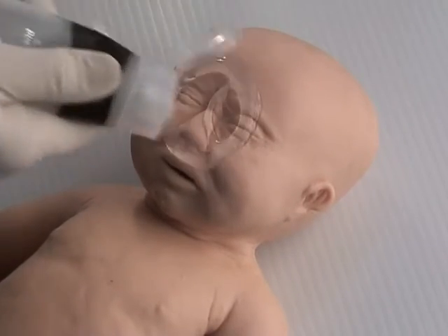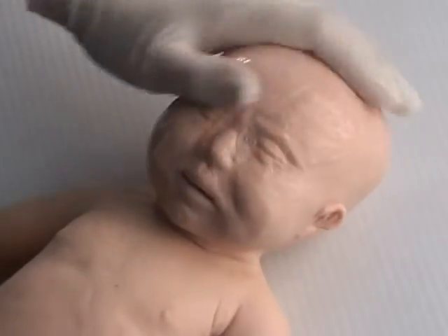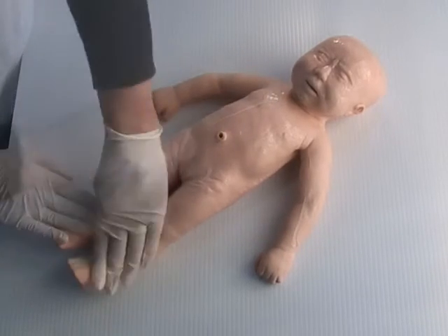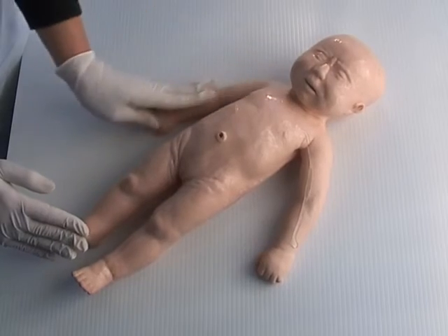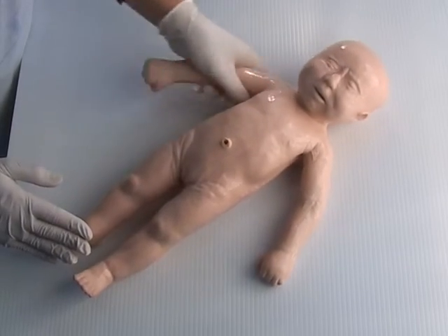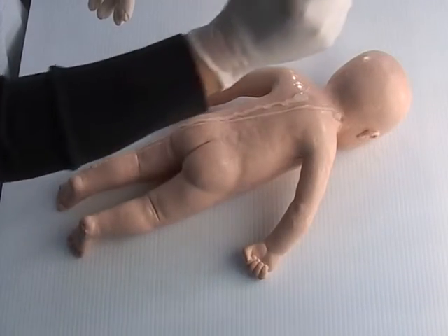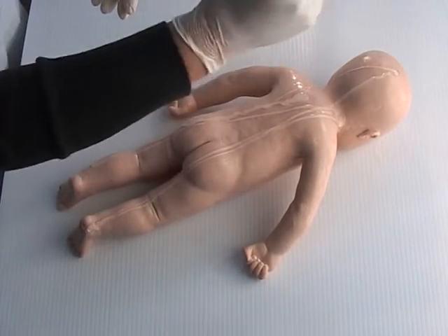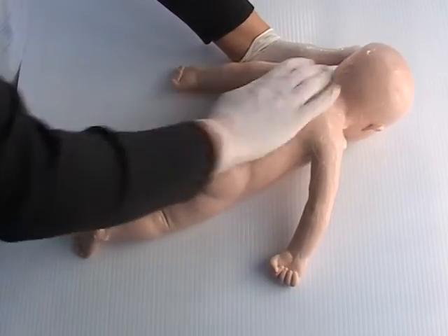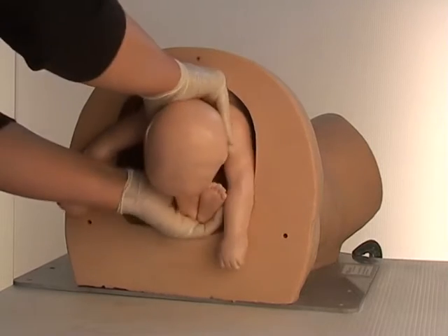Now cover Sophie with a generous quantity of lubricant from head to toe on both the back and the front. Fold Sophie over and insert her into Sophie's Mum's pelvis.